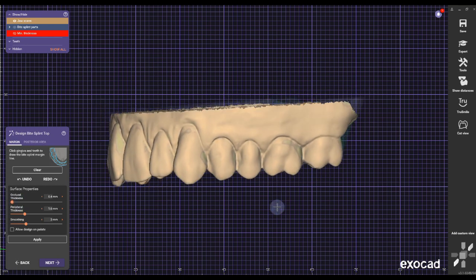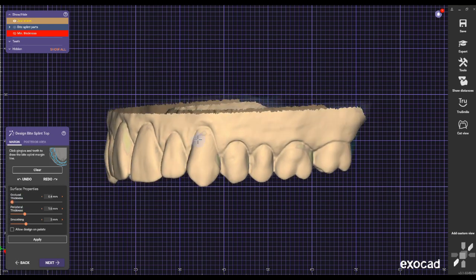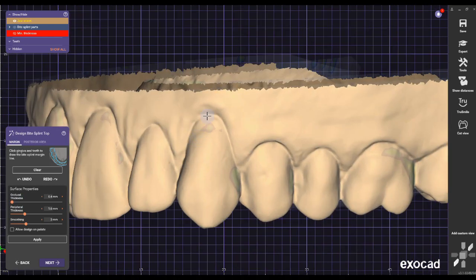What I do is lower my settings. The settings are up to you — you can put it as thin or as thick as you want. I'll show some examples when I'm done with the markings.